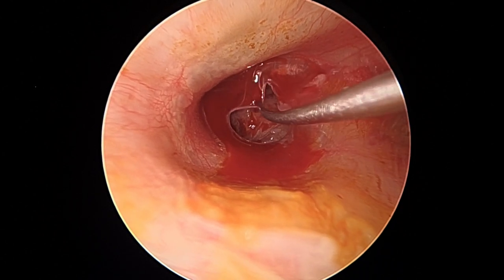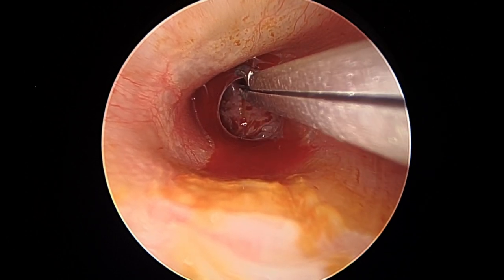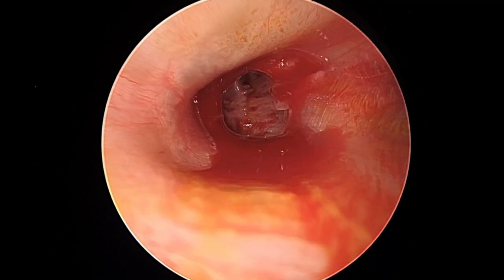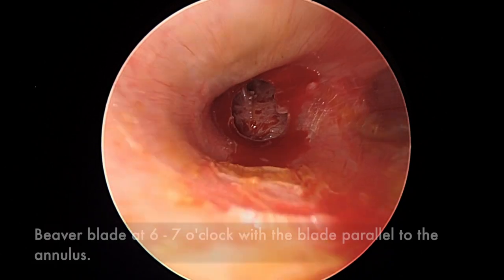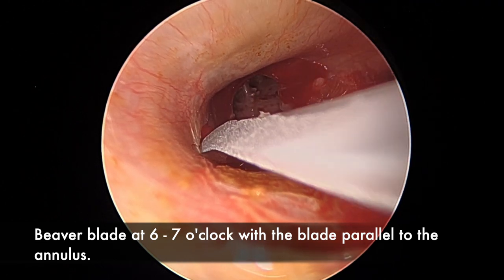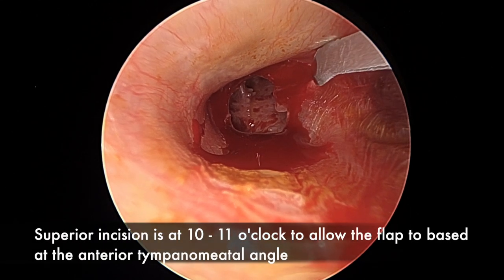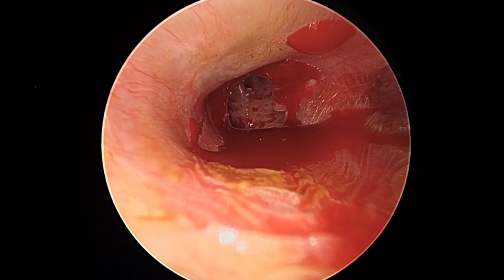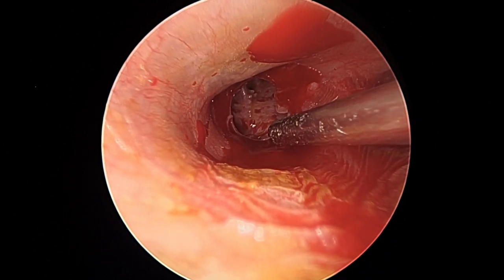Once stripped, we use cups or alligator forceps to strip the rim of the perforation to allow new vessel growth. The classic site of failure is anterosuperiorly, so we need good bleeding there. We then begin beaver blade incisions at 6 to 7 o'clock — the beaver blade must be parallel to the annulus, not tangential, so the annulus doesn't tear across the incisions. Superior incisions at 10 to 11 o'clock allow the flap to be based at the anterior tympanomeatal angle.